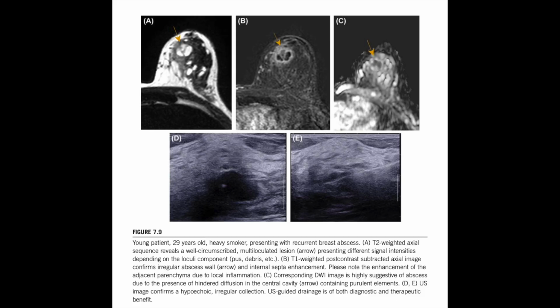And then on top of that, its kinetics can be really concerning. Sometimes it'll show a type 2 plateau or even a type 3 washout. A washout curve on a benign lesion. So that combination of suspicious shape and aggressive kinetics forces a very, very strong consideration of malignancy. So biopsy is pretty much unavoidable. It often is, yes, for the safety of the patient. Although DWI is helpful here, a true malignancy will almost always have a lower ADC value than adenosis. But still, the visuals often dictate the biopsy.